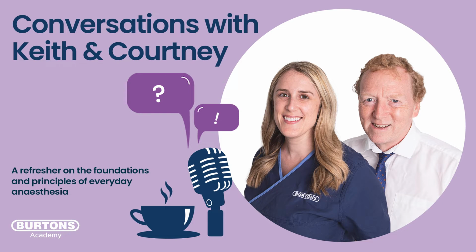CO2 isn't the bad guy in this case. We're not rushing to get rid of it because it's really bad for our body. We're monitoring and making sure it's at a nice normal level so that our body is still in a homeostatic state, really. So it's not the bad guy. Exactly, which is why hypocapnia can be, in the long term, just as bad as hypercapnia. Absolutely. So we really need that CO2 to maintain and regulate the blood's pH. And we're just using capnography as a way to measure this, to assess whether that regulation is correct. That's what we're doing with it.